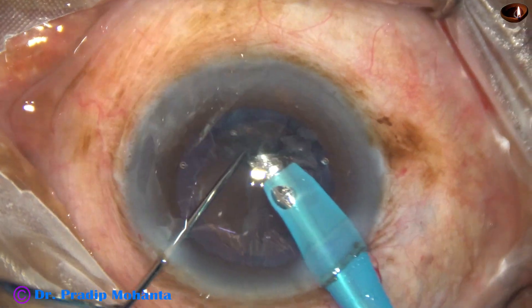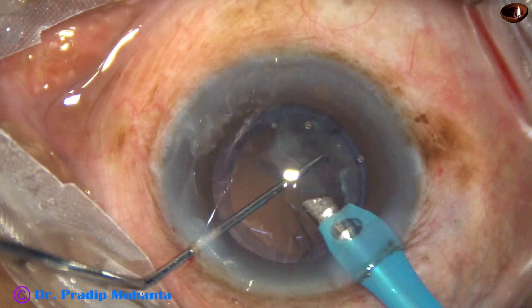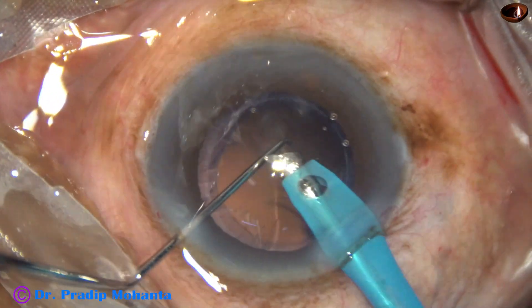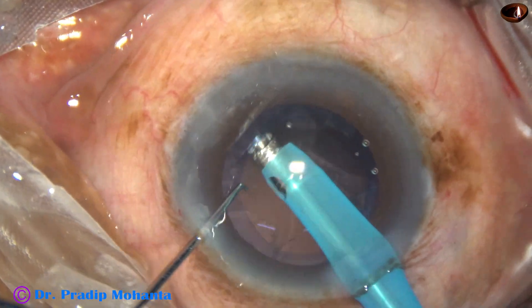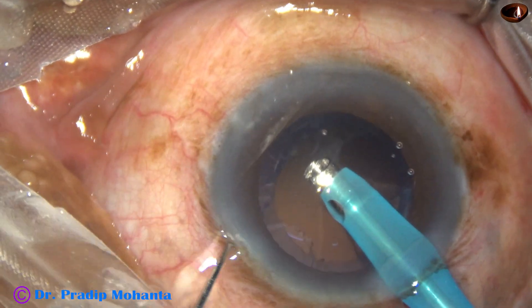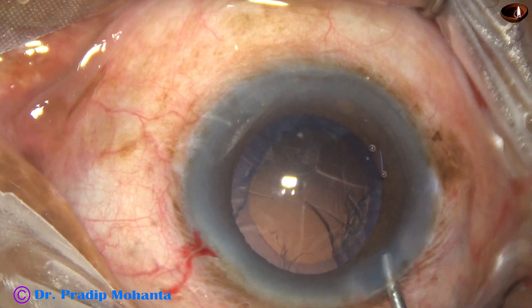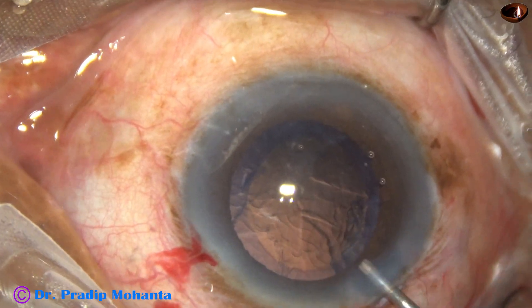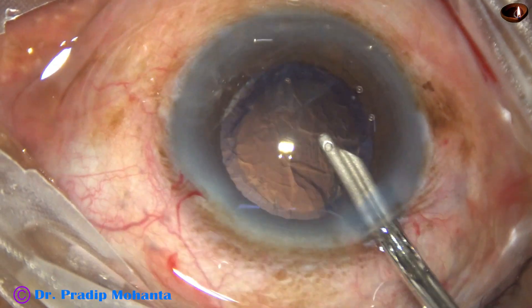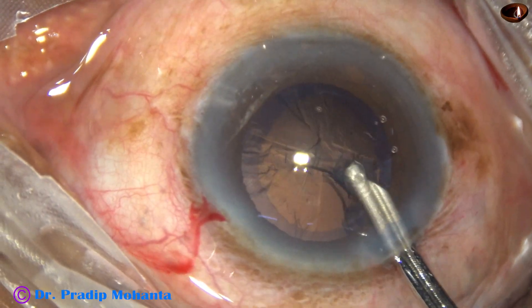And now, this is the epinuclear plate. We have to be very careful at this time, as we can catch the posterior capsule and make a rent. I came out — didn't dare to remove the epinucleus with the handpiece. Injected some visco and used a very friendly instrument: the 23-gauge Simcoe cannula from Appasami Associates.